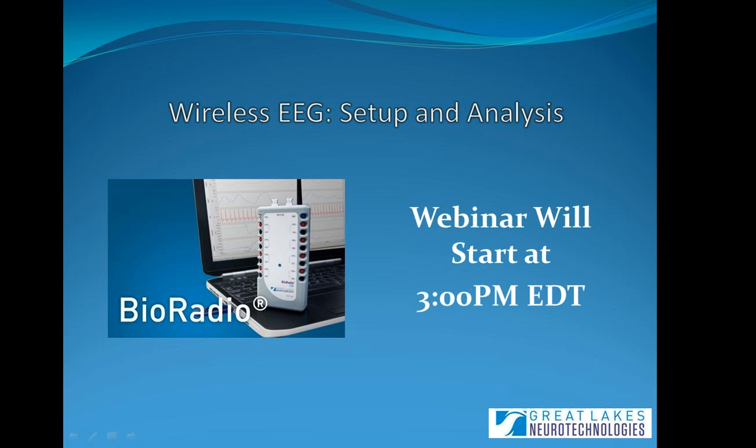Hi, everybody. Thanks for taking the time to join me today for our webinar regarding setup and analysis of wireless EEG data. Just to give you a quick overview, I'm going to be going through several slides talking about some background information about EEG. I'll also go through a demonstration showing you the type of equipment that you can use to wirelessly record EEG, cover some analysis functions that you can do with the signal, and then there'll be a section at the end for questions that I'm happy to answer for you.